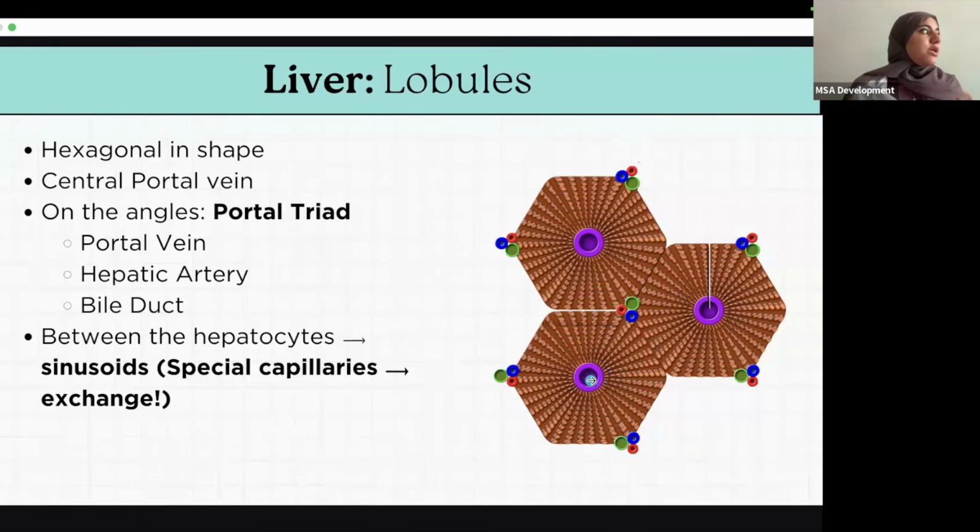Why? So the liver's main purpose is to detoxify. And so it's constantly giving out and taking in blood, giving it out through the veins, taking in blood. That's what's happening right now, okay? And so it sets up a very huge, very complex little system. And these little tiny things are called sinusoids. Sinusoids are another kind of capillary, but in the liver. They're basically a combination of the vein and blood, and this is where all the exchange happens, okay?